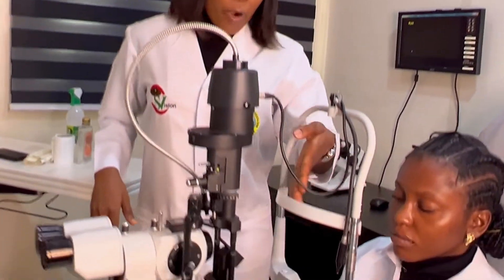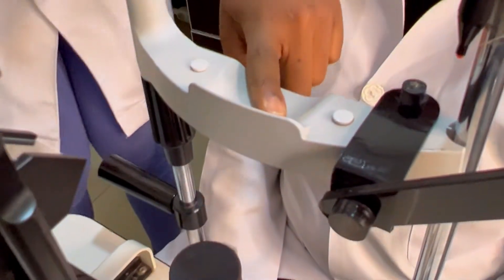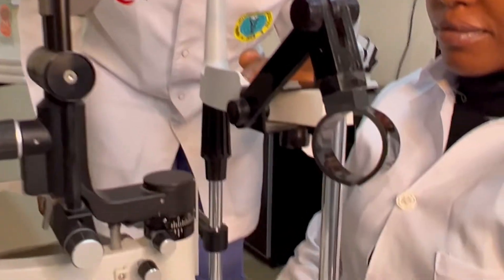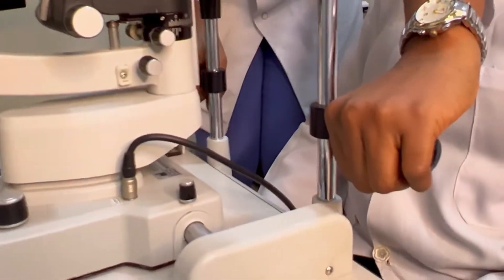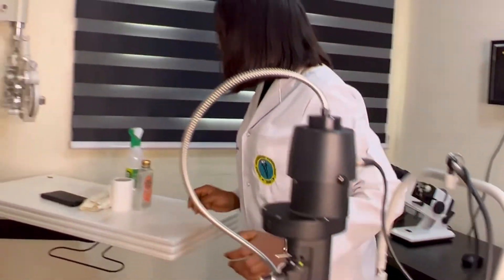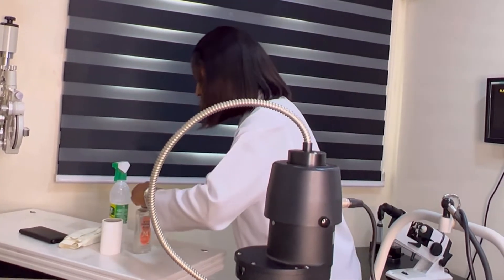After educating your patient, the next thing is to sanitize where the patient's skin or body is going to have contact with your instrument. Here is the forehead rest for proper placement of the patient's forehead, and this is the chin rest for proper placement of the patient's chin. The patient's forehead is going to be resting here and the patient's chin resting here. In some cases, like children, your hand is going to be resting on this hand rest. Please sanitize those places with spirit in front of the patient — do not sanitize the instrument outside the patient's presence.